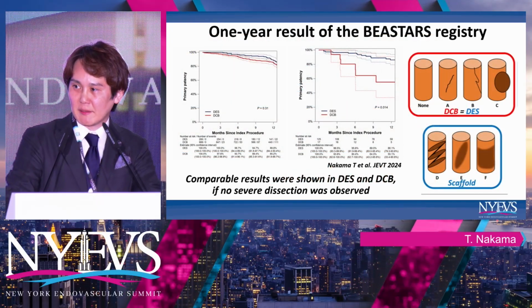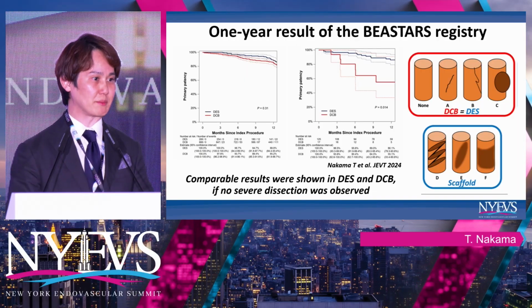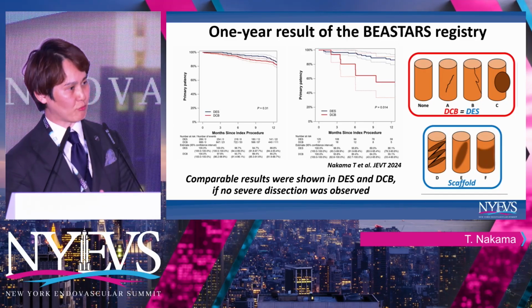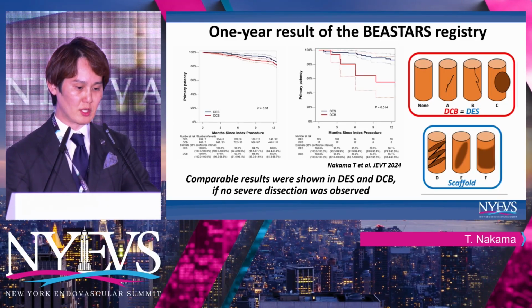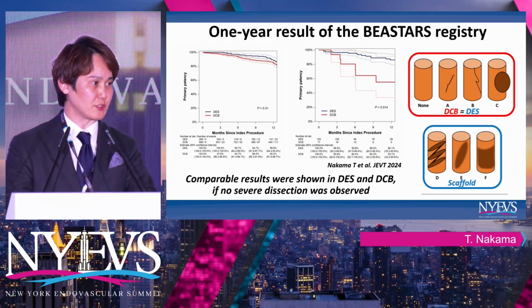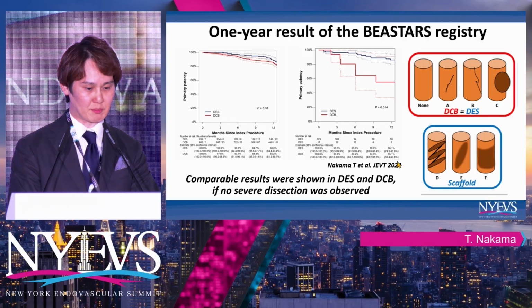Unfortunately, IVUS does not have strong evidence about how to decide between scaffold or no scaffold, or drug technology or not. It means angiographic evaluation is actually sufficient to distinguish these finalizing devices.